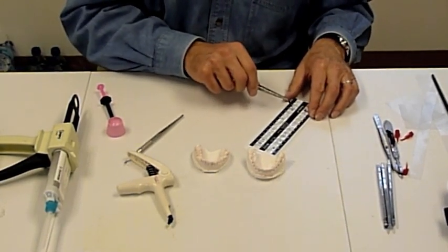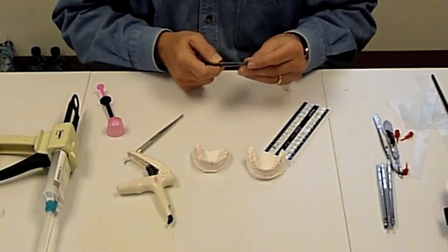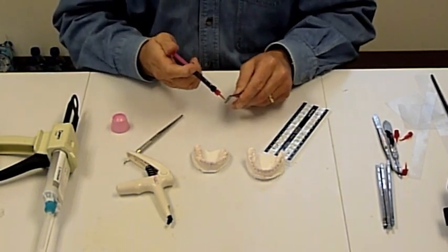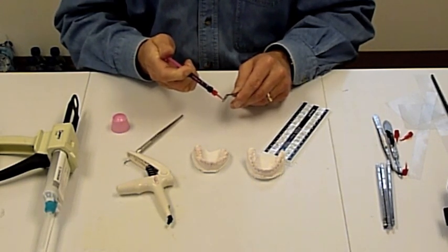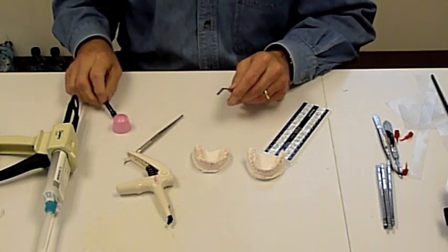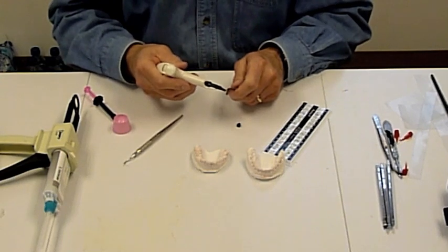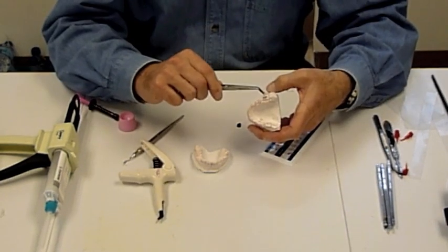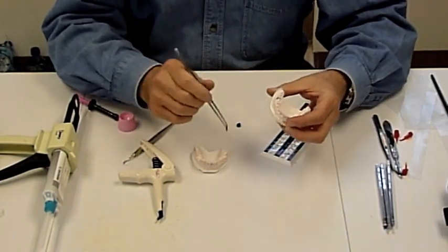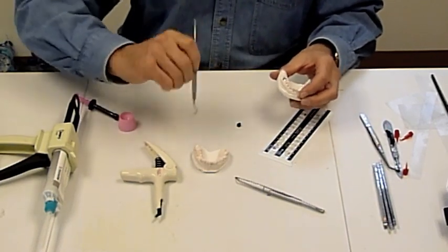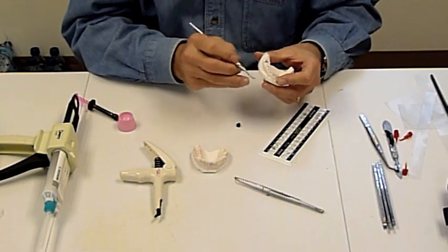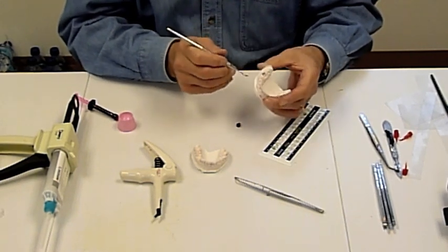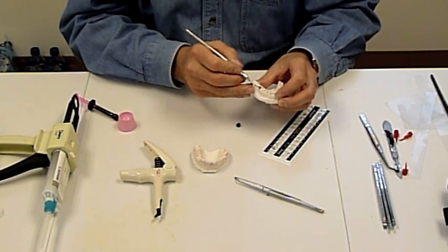We'll start with the lower right molar. We're going to use Opal Seal and Opal MX. Place it carefully on the model at the marked position, and be sure to remove the flash. We now have our molar bracket placed.